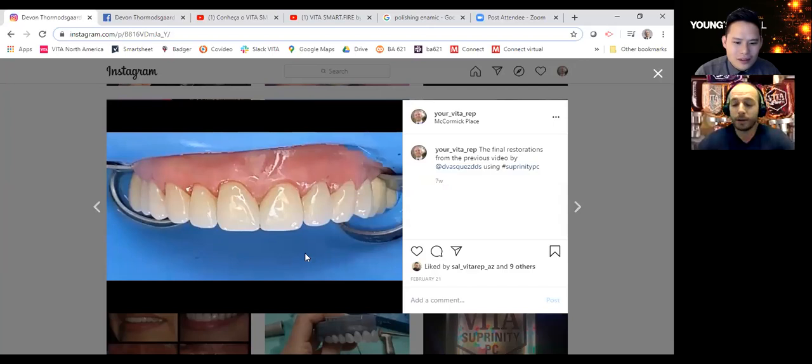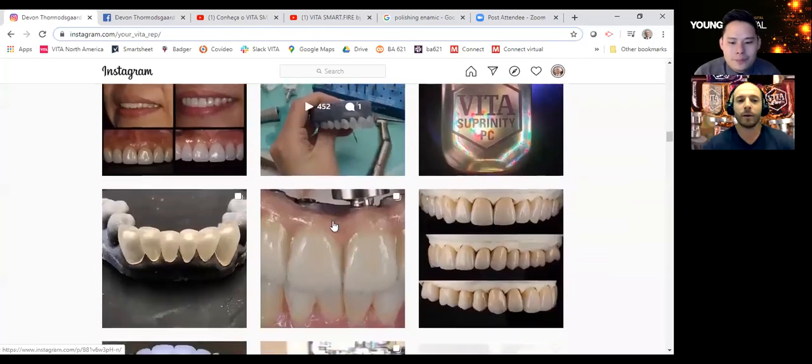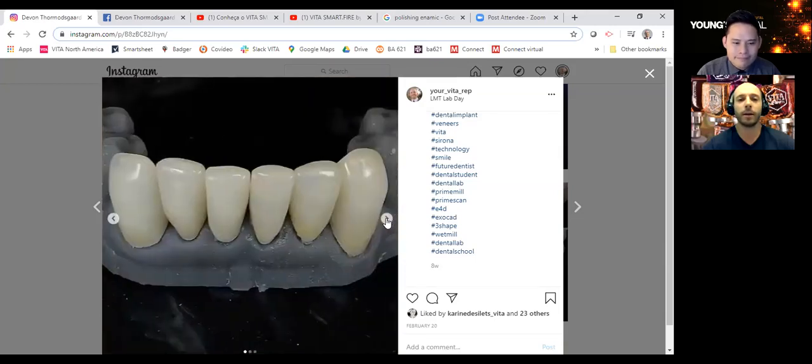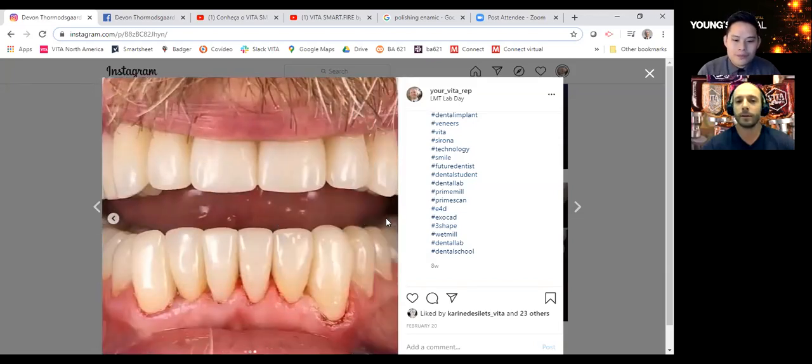One thing people really like about Suprinity aesthetically is the warmth and the natural look. Some other high translucent glass ceramics out there tend to be a little low in value, which means they look a little gray. The fact that Suprinity is the strongest glass ceramic out there at 541 megapascal, but also has that nice vibrant color, makes it ideal for anterior cases where strength is important. This is another picture from Jeff Sumner in Canada — six lower crowns. Here's them in the mouth — beautiful, lifelike.